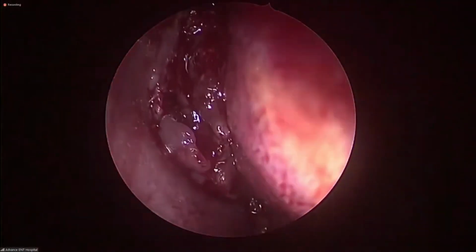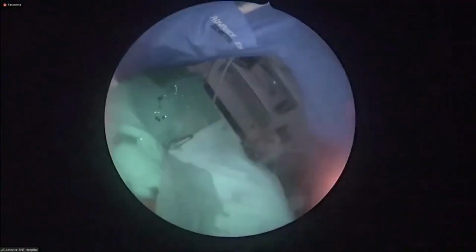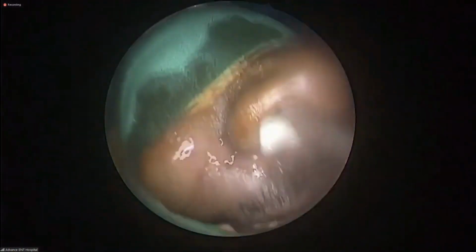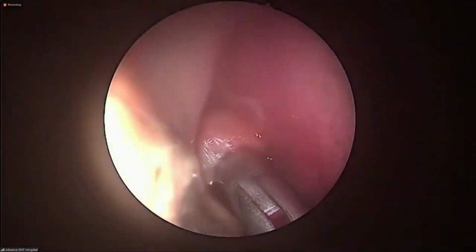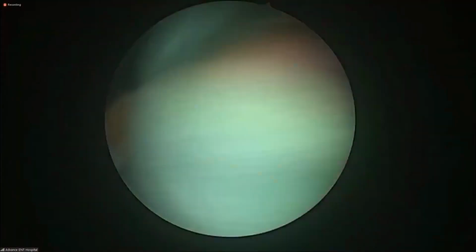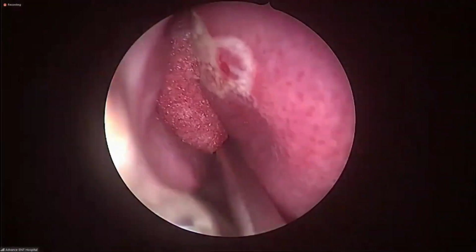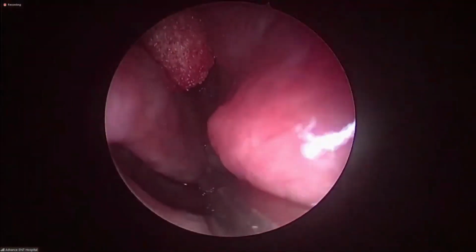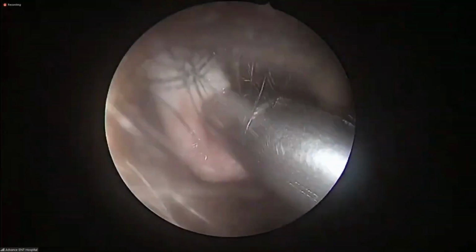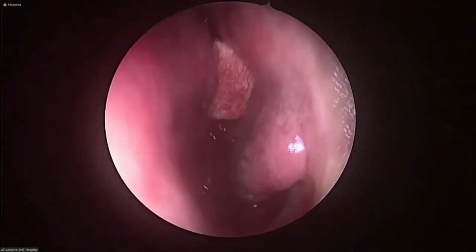This is the condition of polyps. Yes, sir. They are quite inflamed. This is the common problem here, sir. Patient usually doesn't take medicines. He thinks, I'm going to be operated, so why purchase medicines?